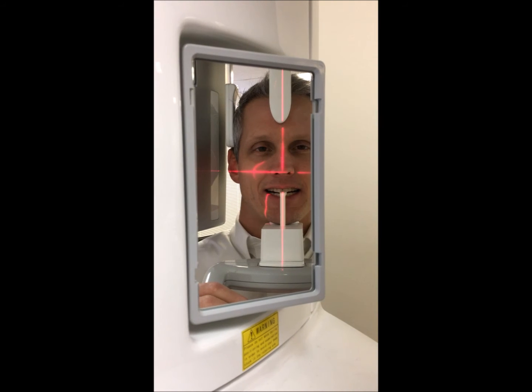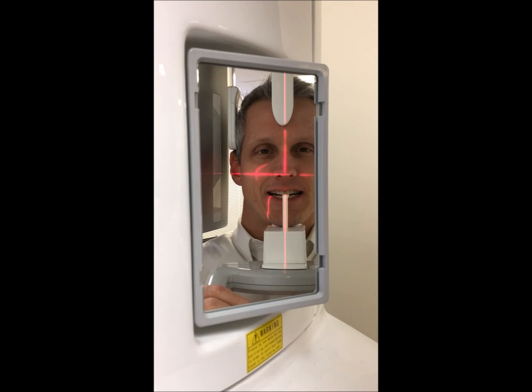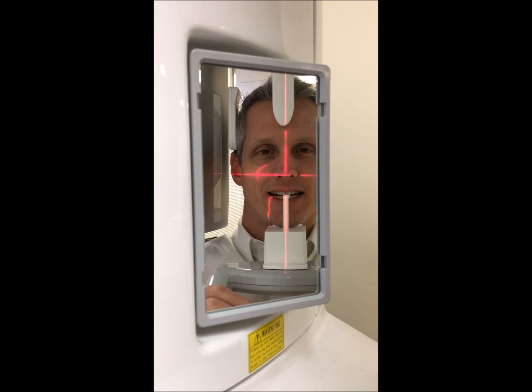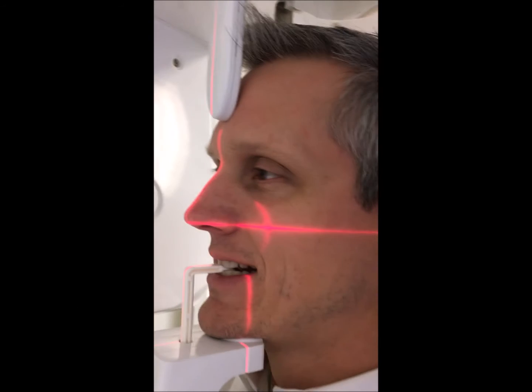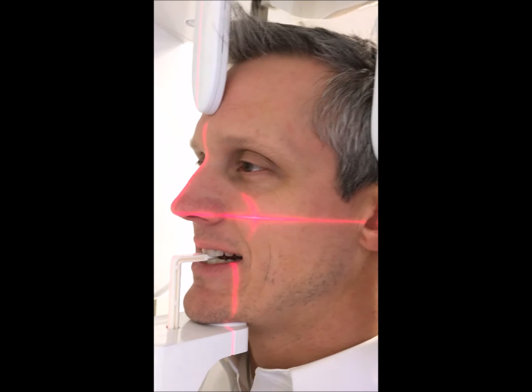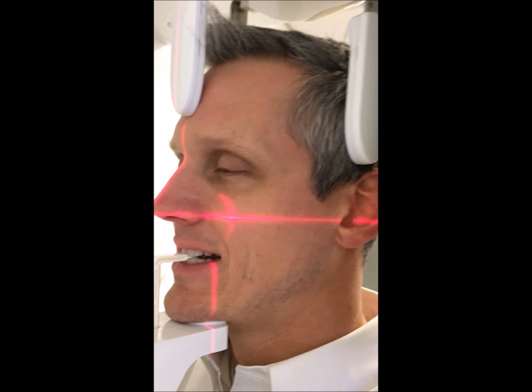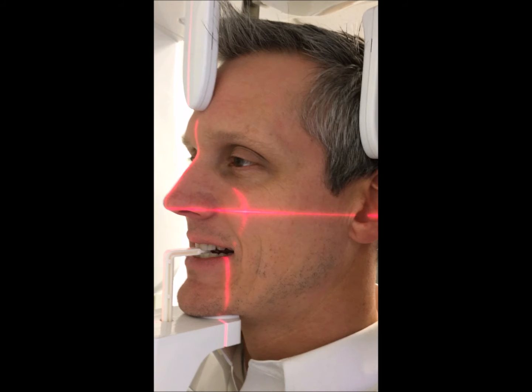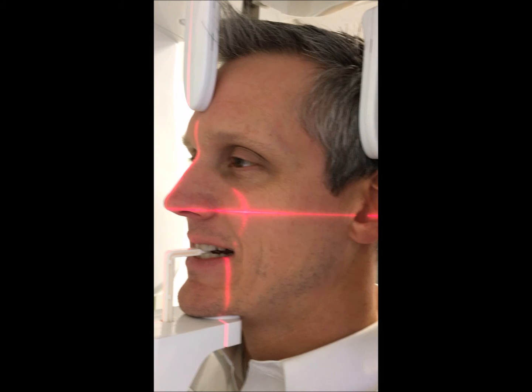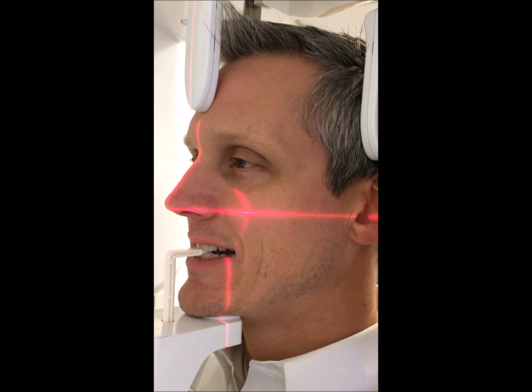If the chin is too high, this is a flat occlusal plane and the pan may look like a frown. If the chin is too low, the pan may come out looking like a smile. The third laser is the canine tooth laser and this should be lined up with the patient's left canine, or position number 11.